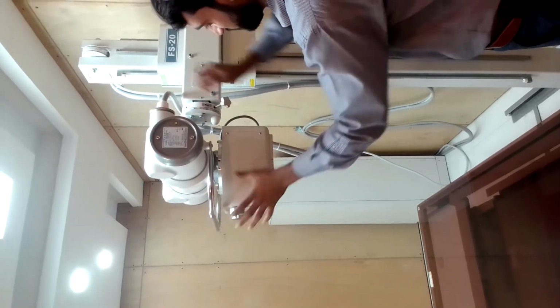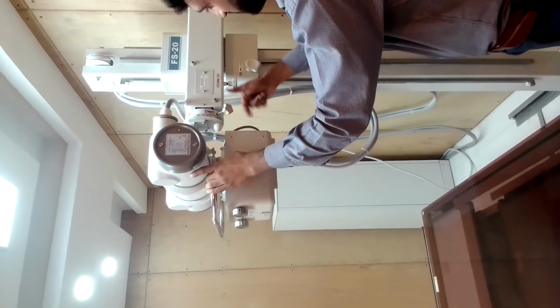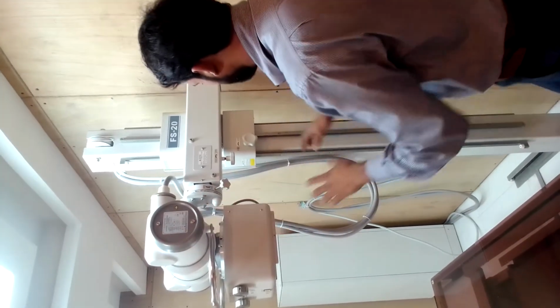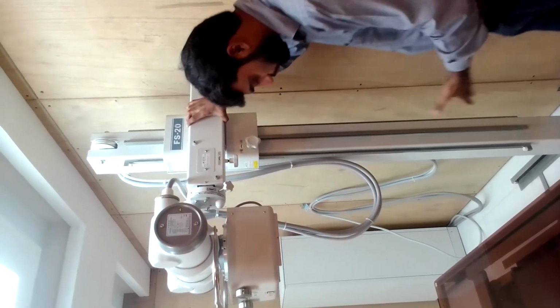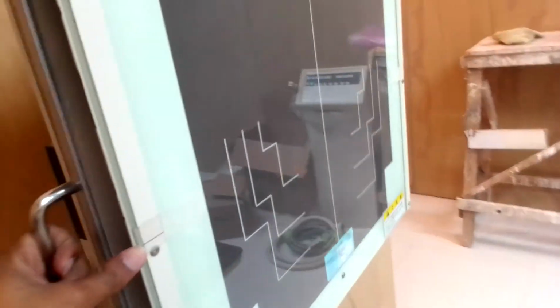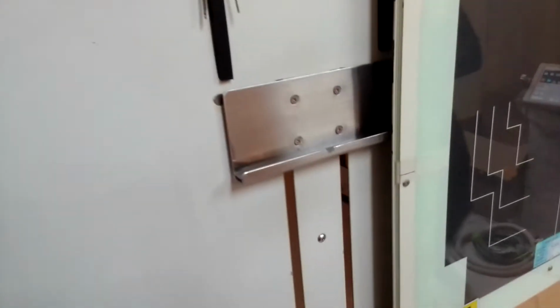With these nuts you can free and lock this tube. And you can see this is the floor mounted X-ray machine, and this is DR for X-ray, just for chest and hand. Here you can put the DR, and this is a grid which removes the scattered X-rays.